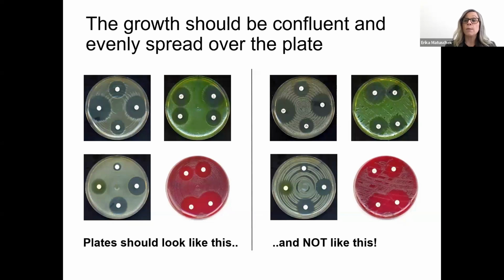to read zone diameters. For the Staph aureus here, this is what happens if you use a rotator, but you move your cotton swab too quickly over the agar surface. So again, no catastrophe, but the expected and best result is the one to the left here. For the Haemophilus strain, we have not covered the whole area. There is some air up here that we haven't used, for example, and also the streaking pattern makes it more difficult to read the zone diameters.